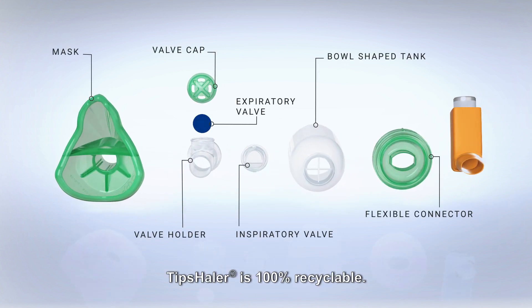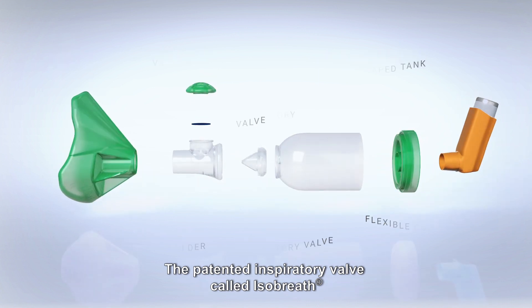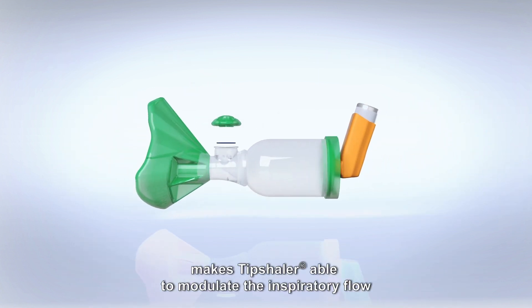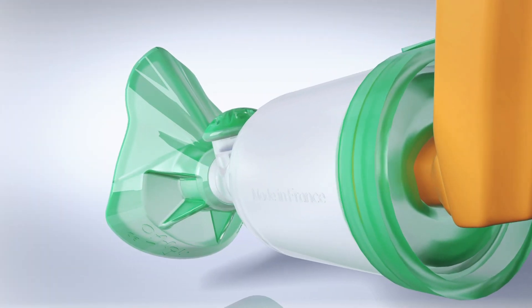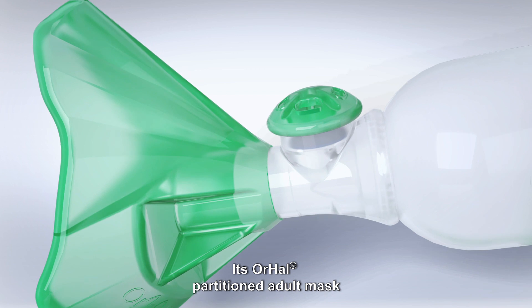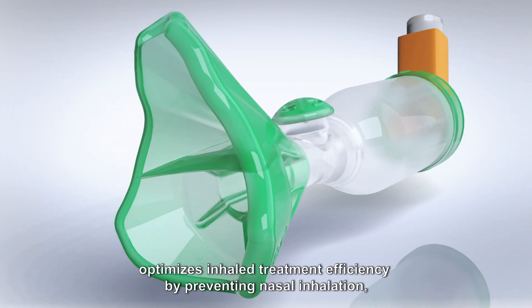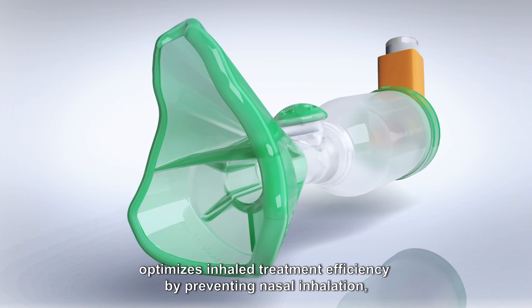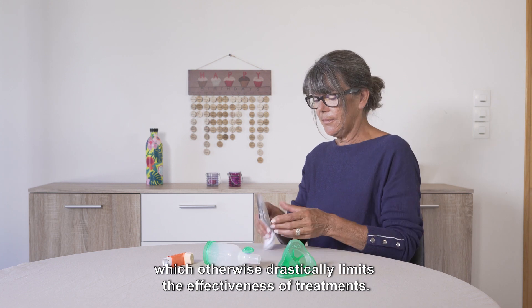TipsHaler is 100% recyclable. The patented inspiratory valve called IsoBreath makes TipsHaler able to modulate the inspiratory flow and fits with every patient. Its oral partition adult mask optimizes inhaled treatment efficiency by preventing nasal inhalation, which otherwise drastically limits the effectiveness of treatments.